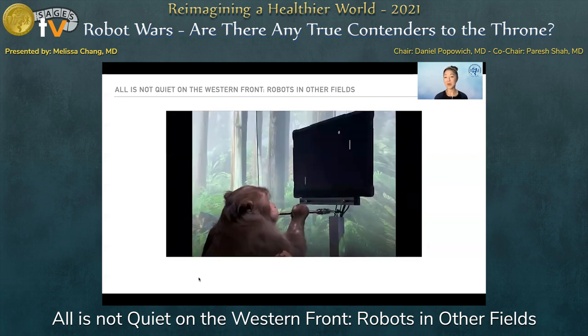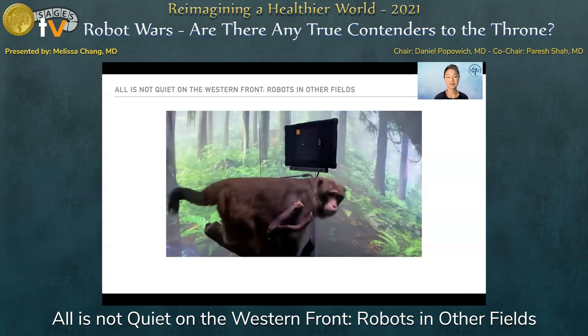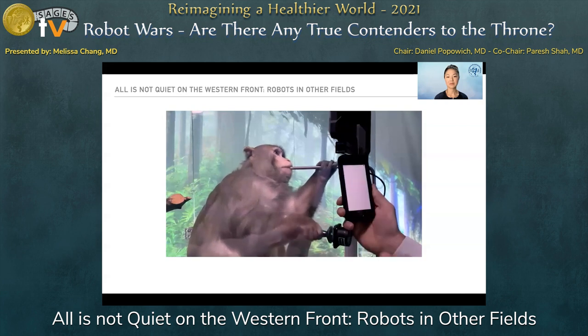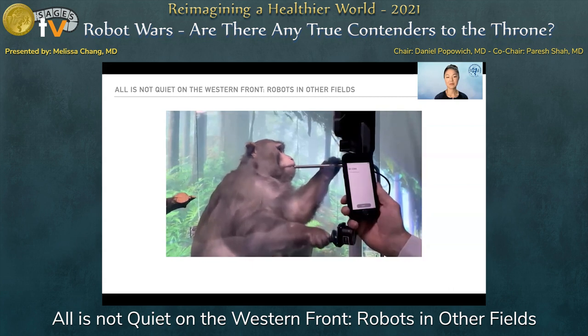So while this idea seems incredibly abstract and maybe something based out of science fiction, this is a primate model that they released earlier this year. This is Pager. He's a 9-year-old macaque who had a Neuralink placed in each side of his brain about 6 weeks ago. If you look carefully, you can see that the fur on his head hasn't quite fully grown back yet. He's learned to interact with a computer for a tasty banana smoothie delivered through a straw. We can interact with the Neuralinks simply by pairing them to an iPhone, just as you might pair your phone to a Bluetooth speaker.